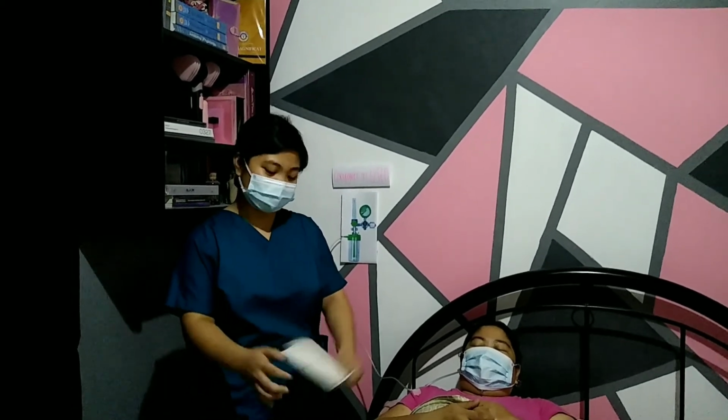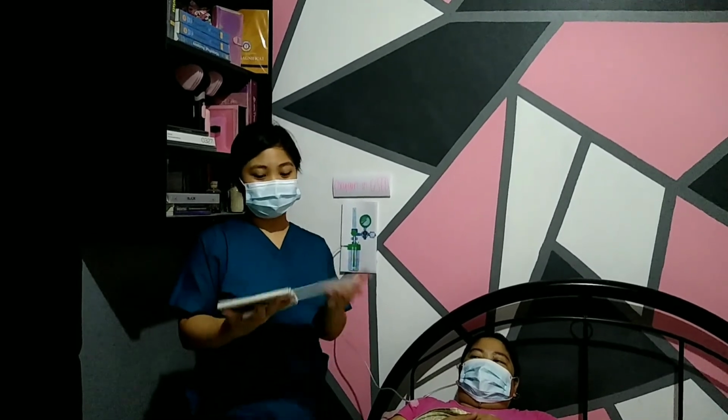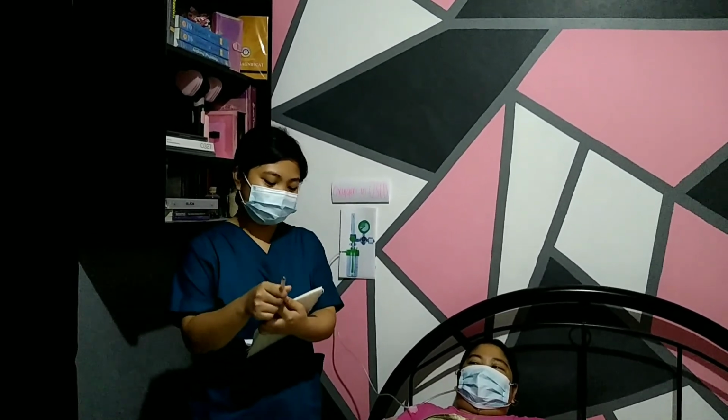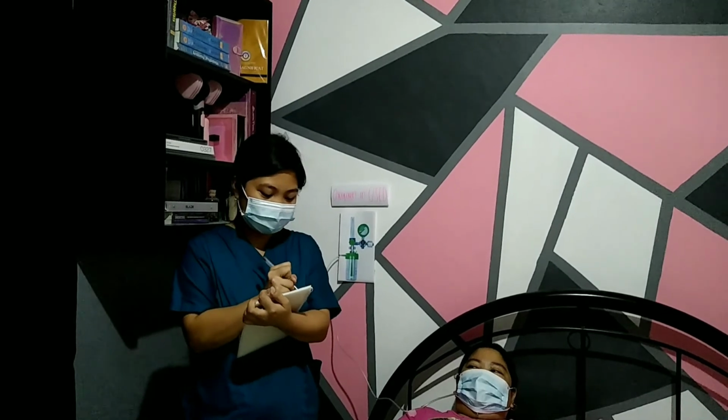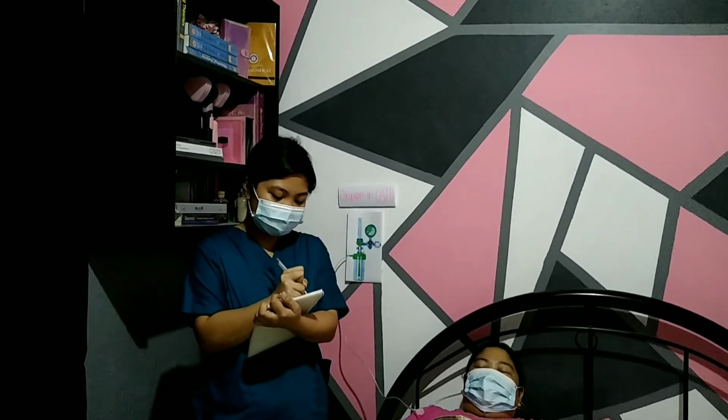And then, of course, as a nurse, don't forget to identify all the unexpected outcomes of your patient. And then the last thing that you need to do is to record all the pertinent information in your appropriate log. And then document the evaluation of patient learning and report the unexpected outcomes to the healthcare provider or nurse in charge.